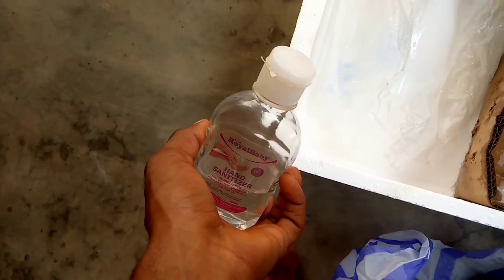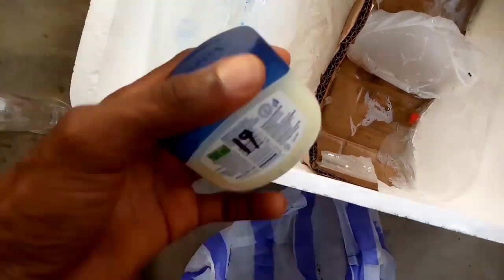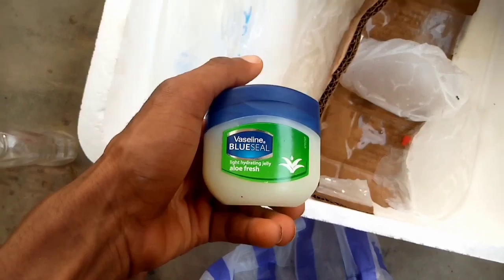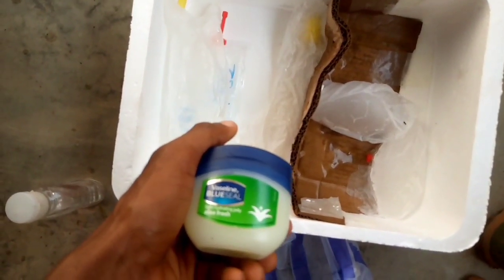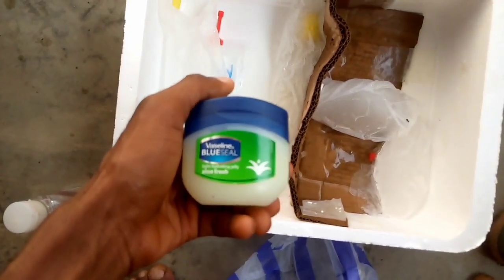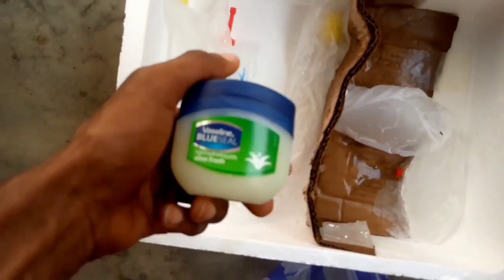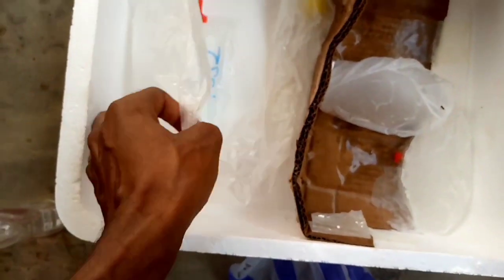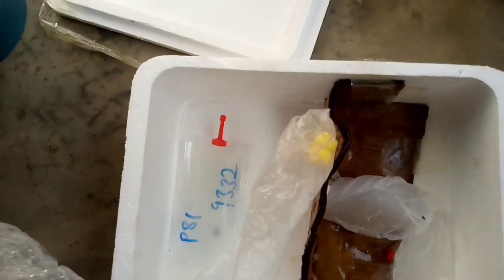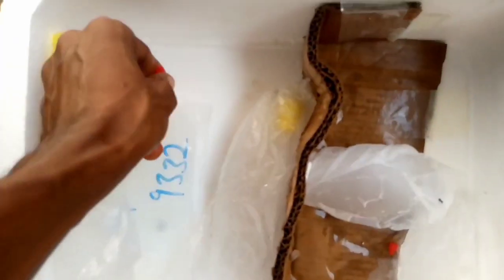This is the sanitizer I'm going to use to clean my hands first before I begin the process. And here is also the lubricant I am going to use — this is a vaseline. And then here is the catheter again, and here is the semen.